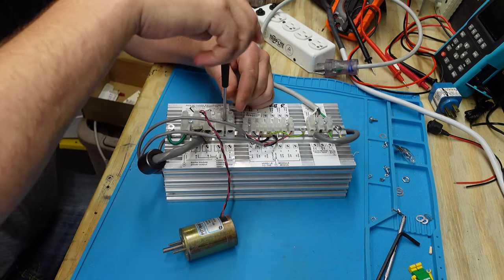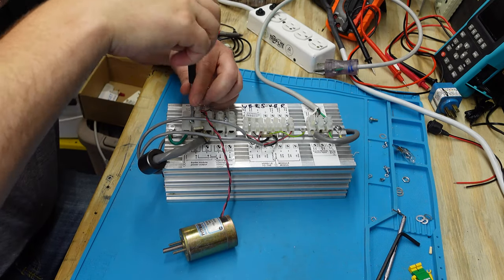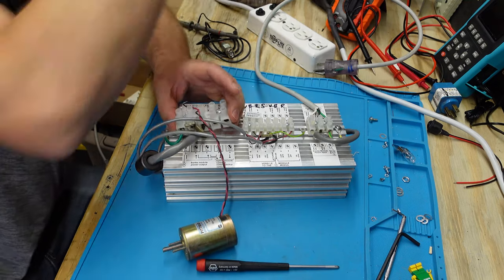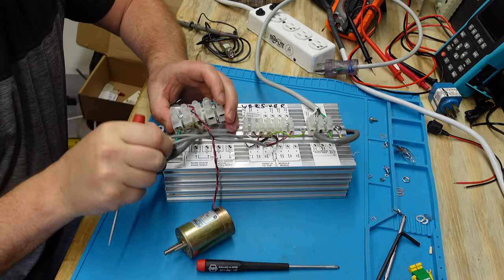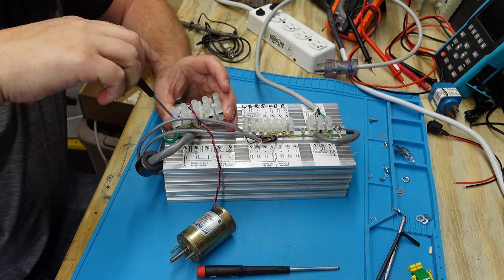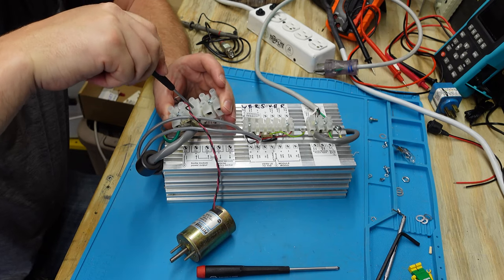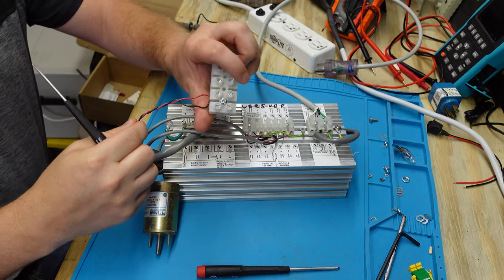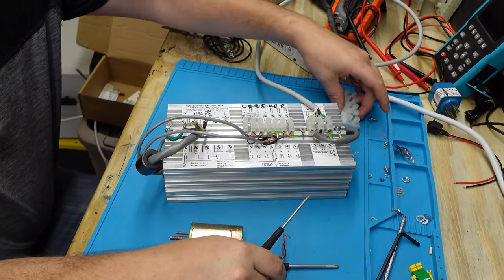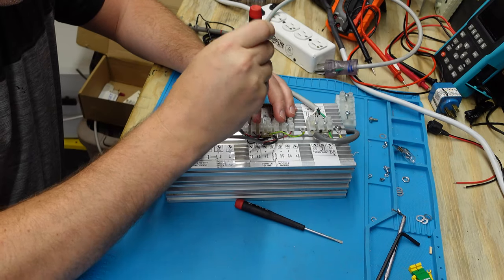Anyway, first thing I got to do is we have to remove these blocks off the top. It's just going to make this whole process a wee bit easier. And I have to disconnect these wires from their terminals. Should be what? This guy. This guy. This guy. Alright. These are good parts to salvage anyway. Can use them in my test setups. All right.